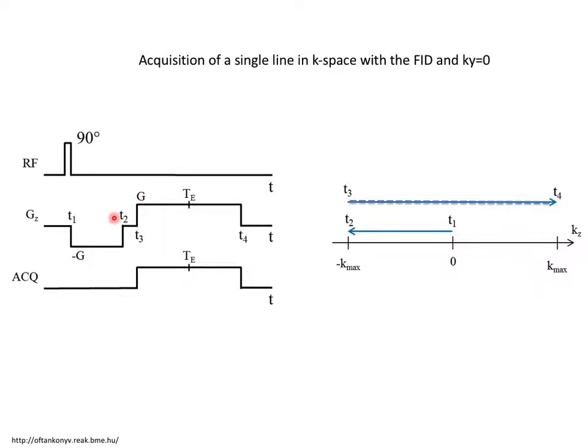And so when I apply a 90-degree pulse, I can apply a gradient here which will change the phases of the magnetization vectors in the transverse plane and move the sample itself to a different point in the Fourier space, so it moves down to here.